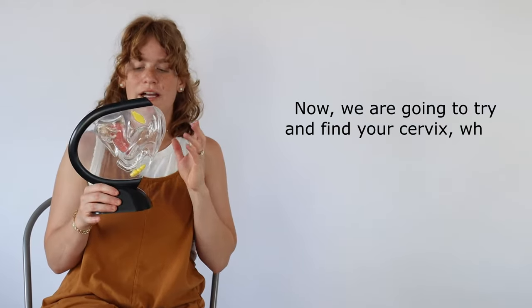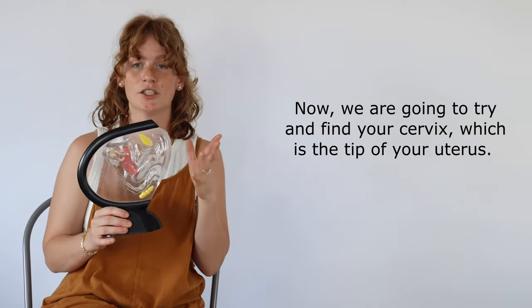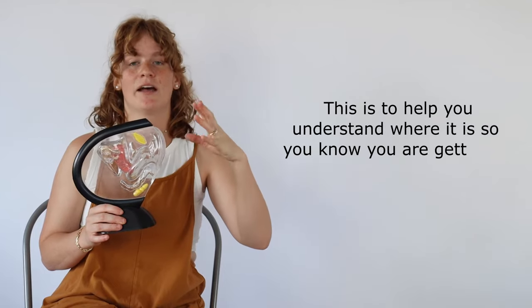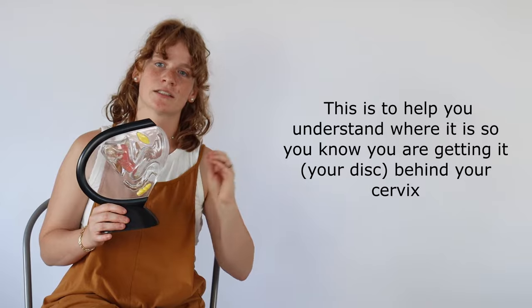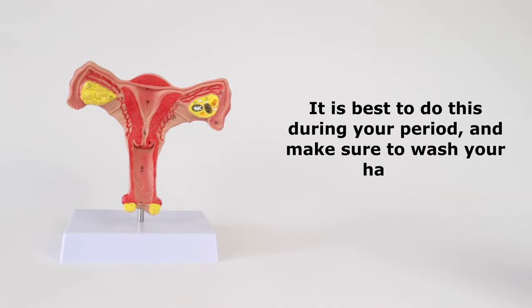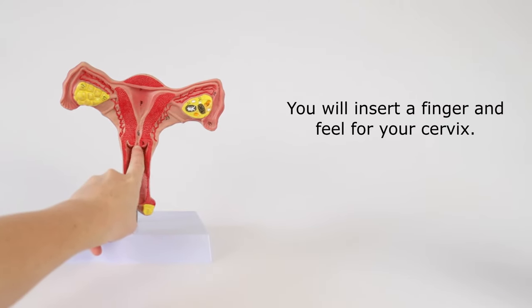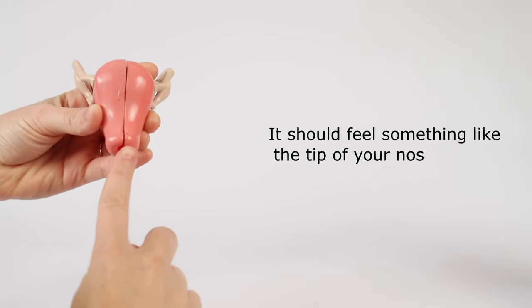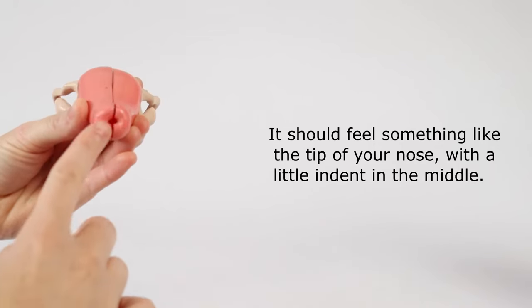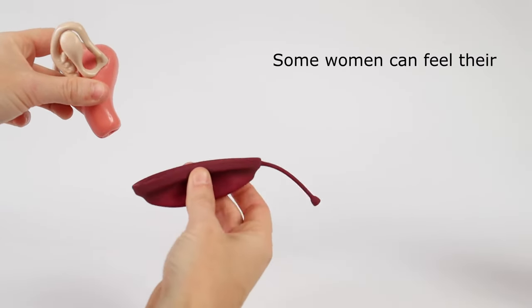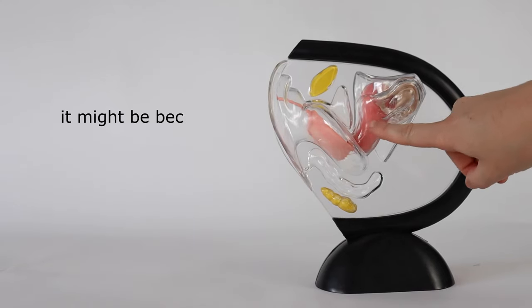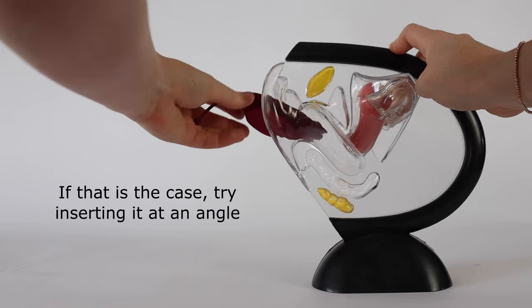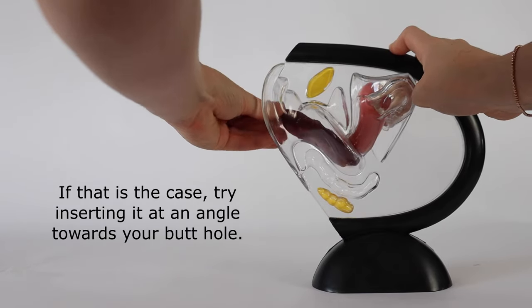Now we're gonna try to find your cervix which is the tip of your uterus and this is just to help you understand where it is so you know if you're getting it behind your cervix. You will insert a finger and feel for your cervix. It should feel something like the tip of your nose with a little indent in the middle. Some women can feel their cervix so if you're inserting your disc and it hurts it might be because you're hitting your cervix. If that is the case try inserting it at an angle towards your butthole.